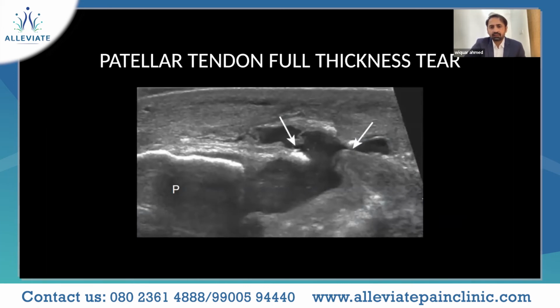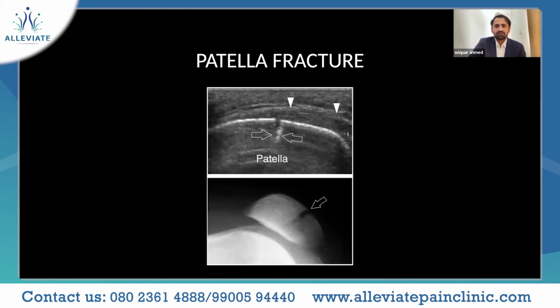This is a full thickness tear where the distal part is actually cut off completely, retracted. Proximal part is there with your heterogeneous hematoma, joint effusion.